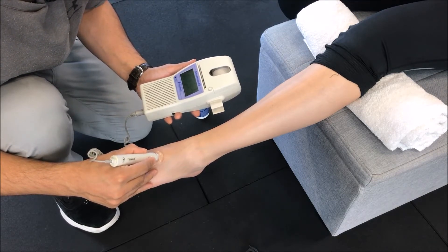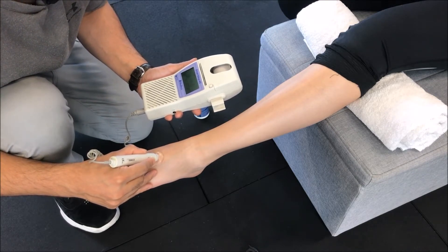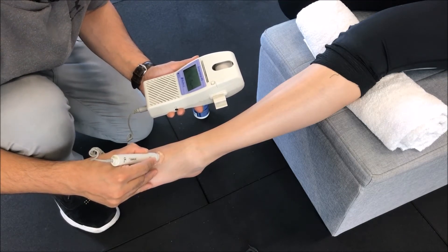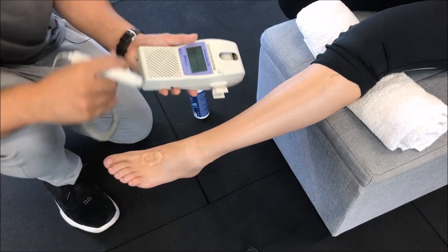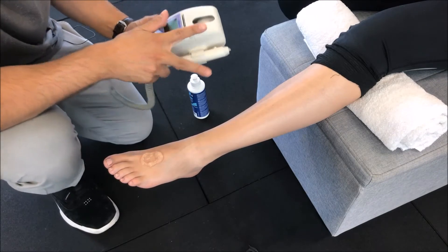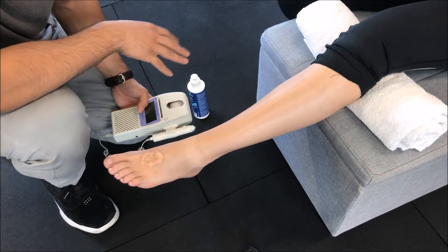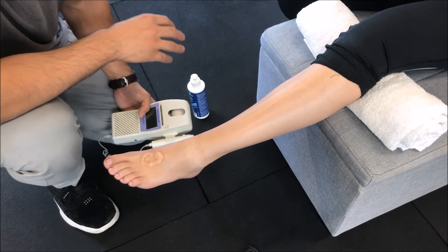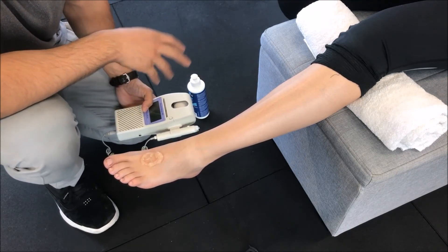That is a very good pulse. What we usually listen for is how strong that pulse is and whether there are any irregularities in its beats. This is a crucial assessment for diabetics because in the long run we always want to be preventing any sort of infection, and we always want to confirm that the vascular and arterial system has no issues.